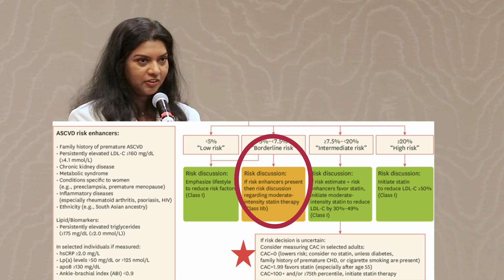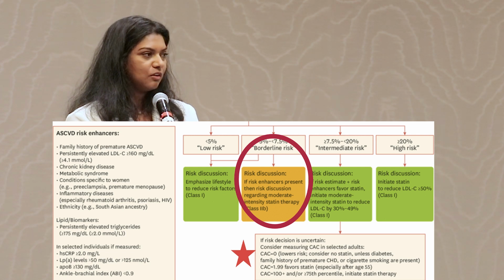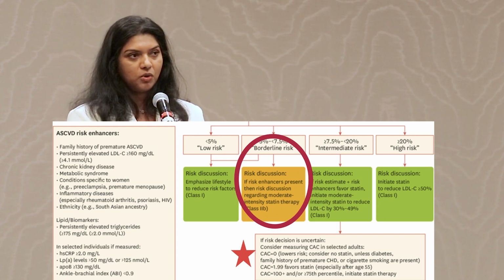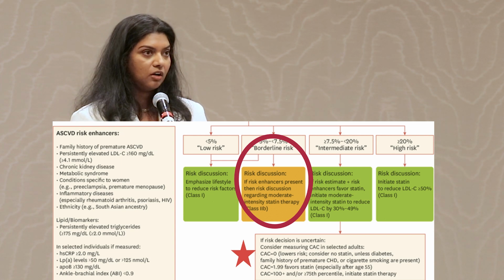Oh yes, don't go on the internet, don't go on TikTok. It has a lot of bad news on it. But when you actually do this imaging, a calcium score, very cost effective, about $99, takes about 5 minutes to scan, you can have a much more crystal clear picture of their heart risk.